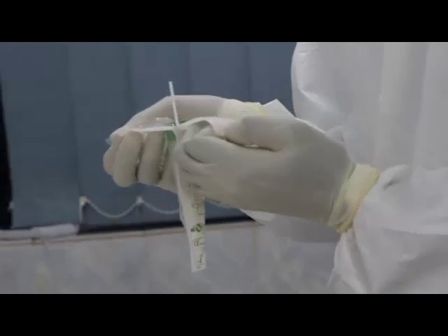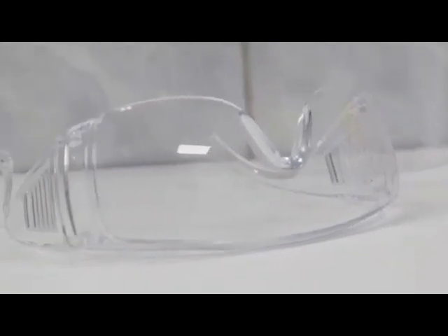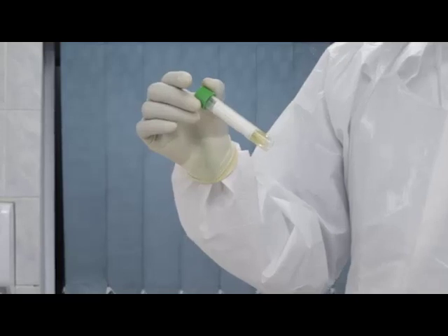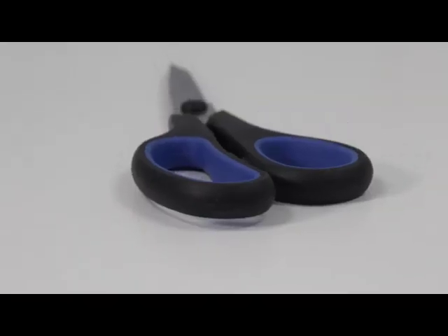One, nasopharyngeal swab. Two, oropharyngeal swab. Three, goggles. Four, gloves. Five, surgical mask. Six, viral transport media vial. Seven, marker. Eight, scissors.